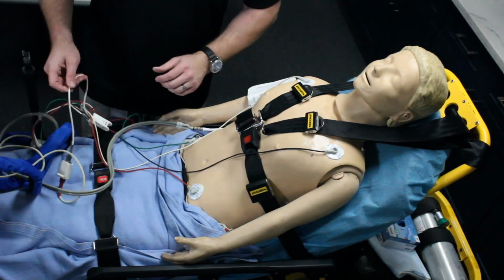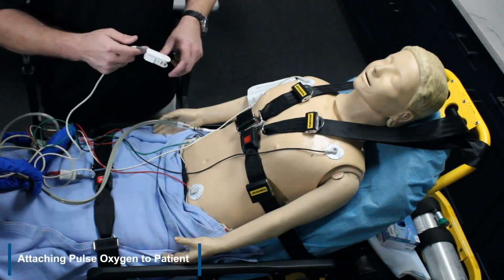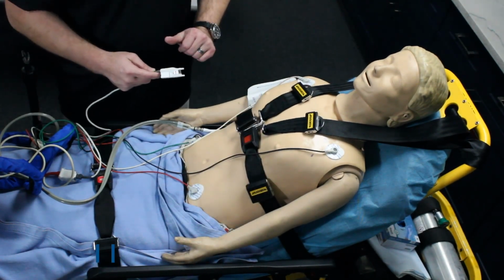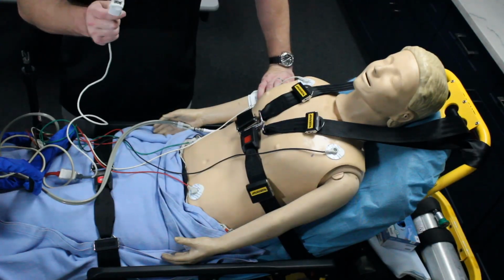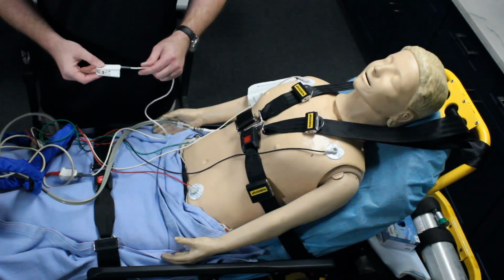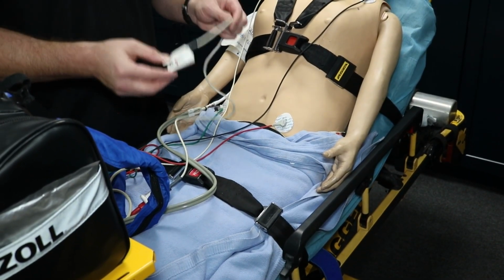Lastly, we are going to hook up our pulse ox. With our pulse ox, I like to make sure that we utilize it on the opposite arm of the blood pressure cuff, so that way when it takes the blood pressure, it doesn't interfere with any pulse ox reading. But again, talk to your nurse, find out which one they like, which finger they like to use. Make sure that it's not a finger that has any dark nail polish on, which might interfere with any reading.